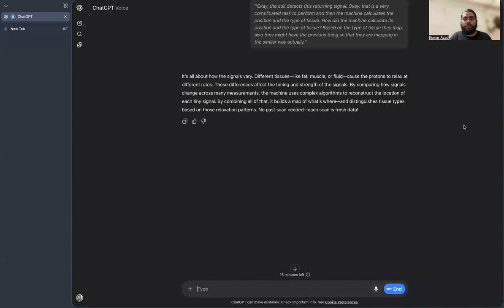Oh, they actually have the real relaxation time for all those different parts, and based on that, they map.